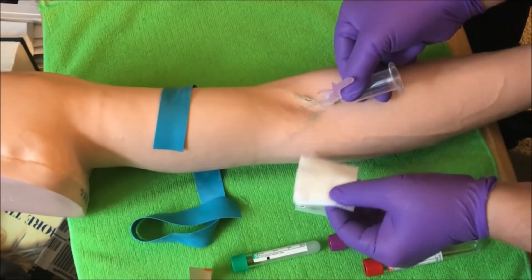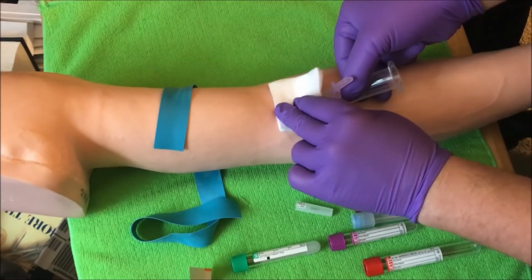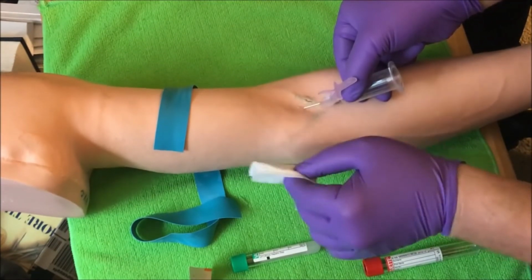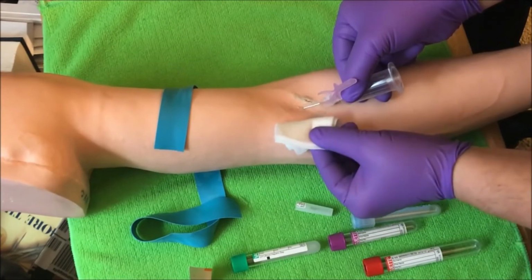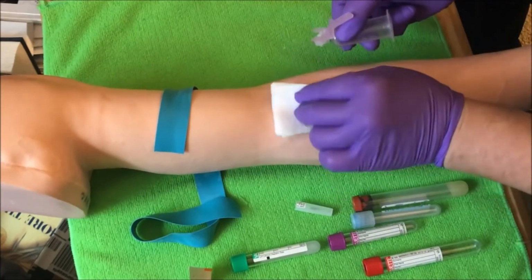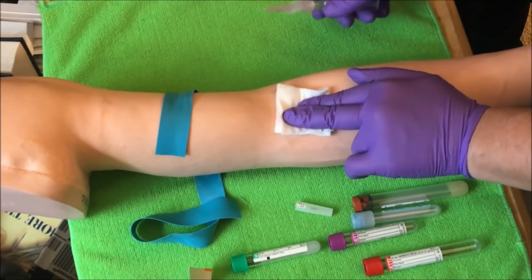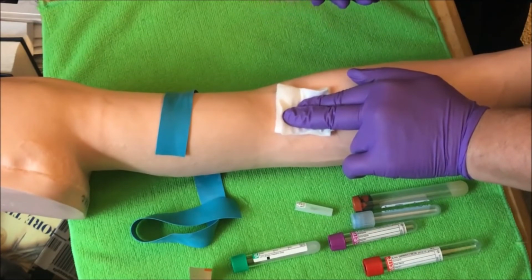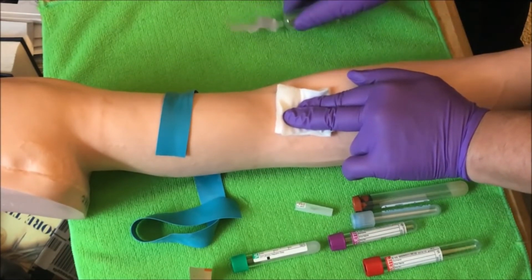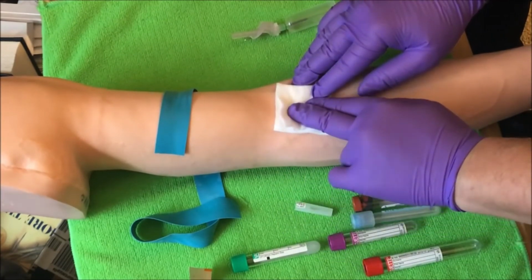So once I'm in, do not bring your hand over. It is dangerous. I've seen people get stuck that way. I come on the side right here next to the arm. I bring my needle out, and as I move away, I cover and place my 2 fingers over the site, immediately capping my needle. Once I cap it, then I dispose of my needle, and I keep pressure here, or I have the patient put pressure over here.